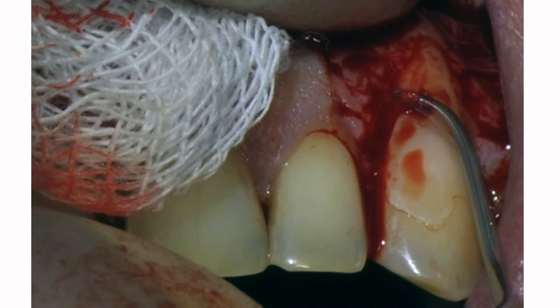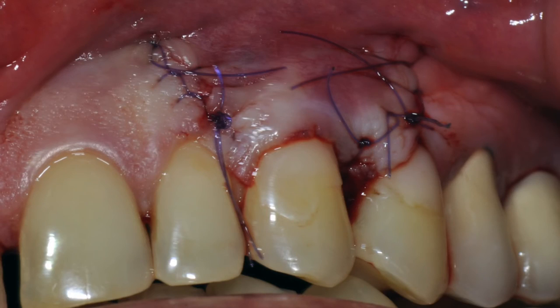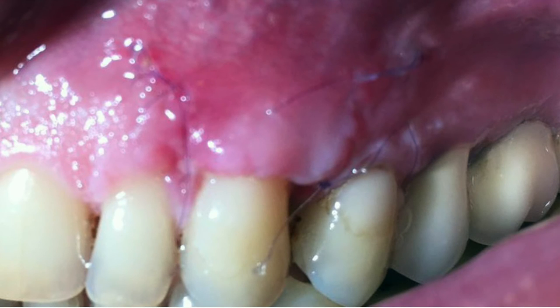Во всех этих методиках поверхность корня обрабатывается по одному и тому же принципу, как мы уже обсуждали. Вот непосредственно после операции — здесь уже сразу видно, насколько хороший объём у пациента, и толщина кератинизированной десны, и её ширина. Это снимок через 2 недели — этап снятия швов.